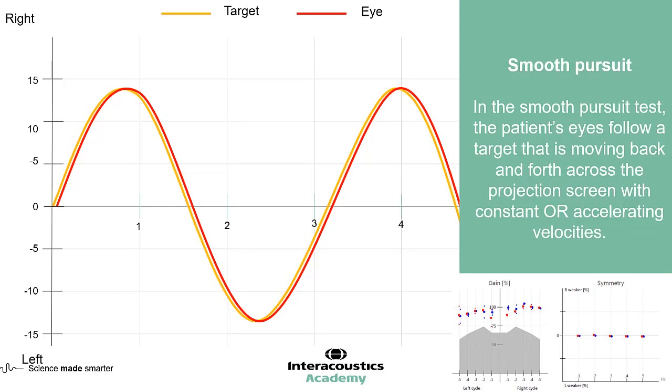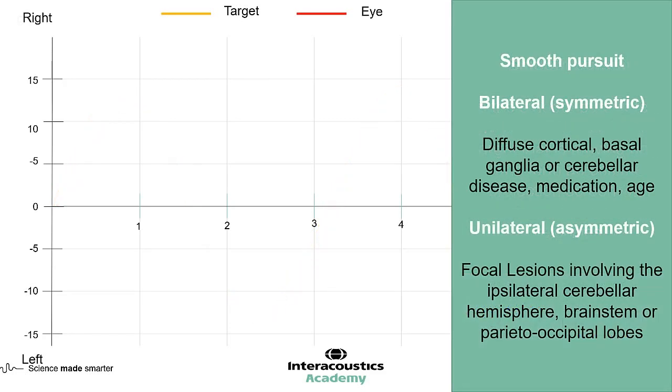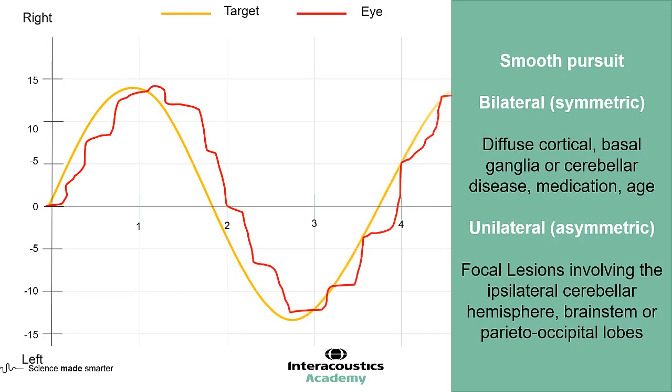Here is an example of a bilateral symmetric abnormality. What we can see is we've got correction being applied both to the right and to the left directions to keep the eye tracking with the trace.